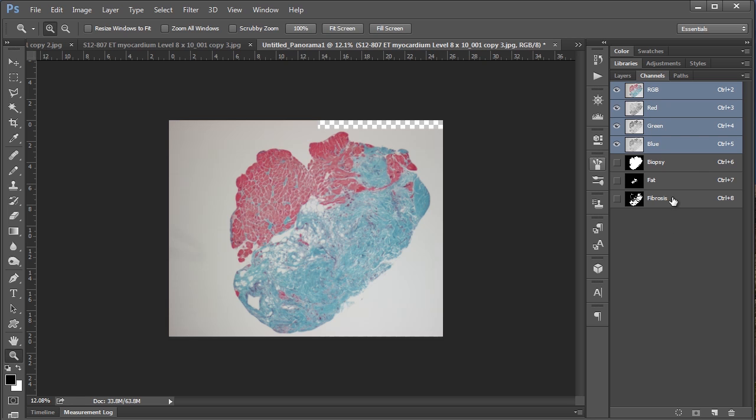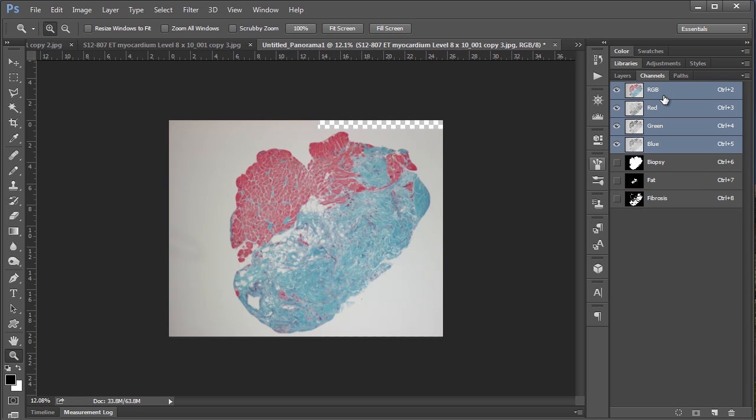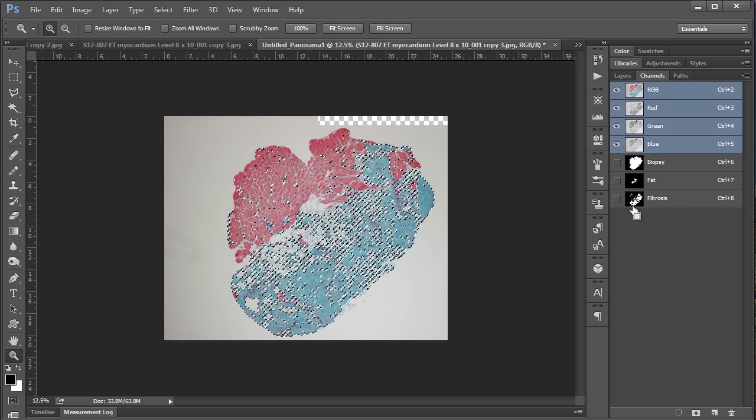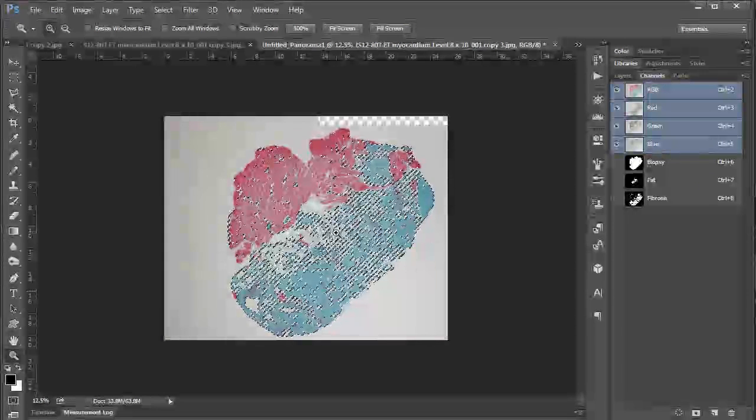And I can tell you when I did it yesterday that fibrosis gave about 48%, which you know probably looks about right given this selection here.